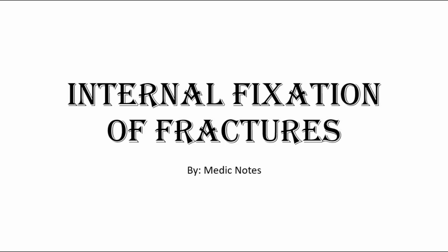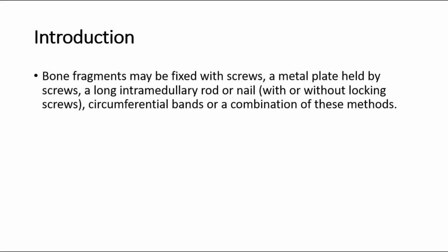This video will be on internal fixation of fracture. In internal fixation, bone fragments may be fixed with screws, a metal plate held by screws, a long intramedullary rod or nail, with or without locking screws, circumferential bands, or a combination of these methods.